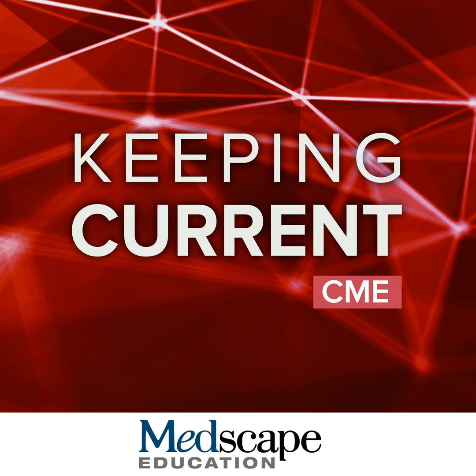For example, if a patient has multiple small, say 1 to 2 centimeter regions of edema, based upon the multiple regions of discontiguous signal abnormality, that would be moderate ARIA-E, but in that case, it would not be detected. It would only be those larger regions of edema that we would be able to confidently see on CT. So small regions of ARIA-E are not adequately detected on CT, and also ARIA-H, microhemorrhages, and superficial siderosis would not be able to be detected on CT.